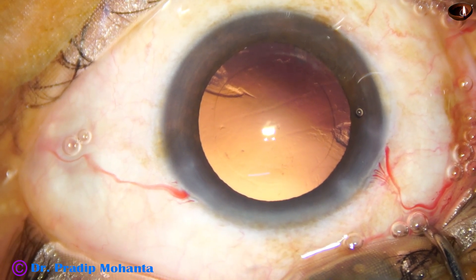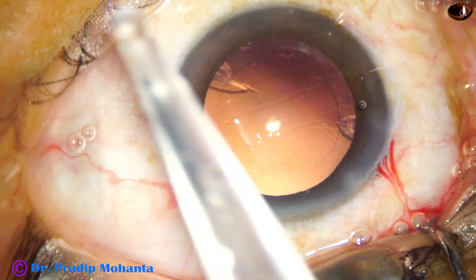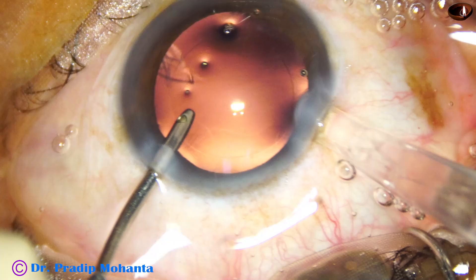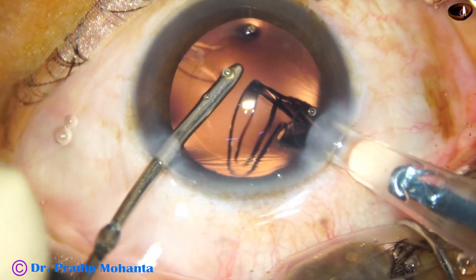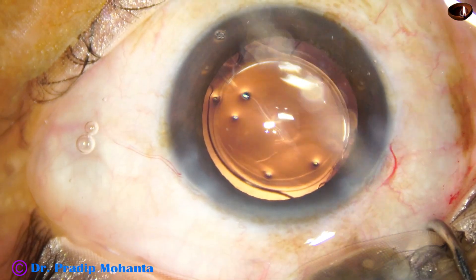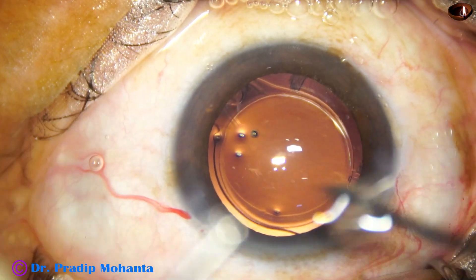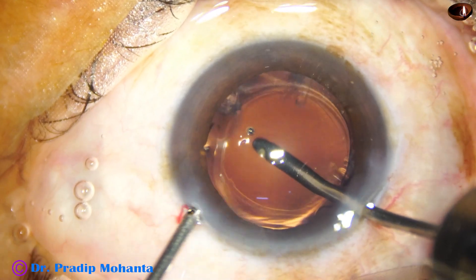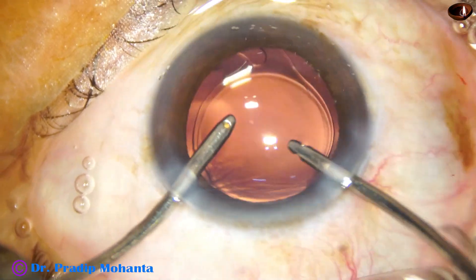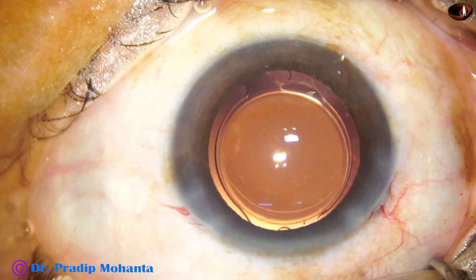There is a small bit of cortex on two sides at around 10 o'clock and 4 o'clock, but we can remove that after implanting the intraocular lens. This is hydroimplantation of the intraocular lens — this is a single-piece hydrophilic intraocular lens. The lens goes in the capsular bag. Now we take the irrigation and aspiration and the remaining cortex is removed. The advantage of this technique is the lens itself protects the posterior capsule. As you try to hold the cortex, the posterior capsule is kept away by the intraocular lens itself.